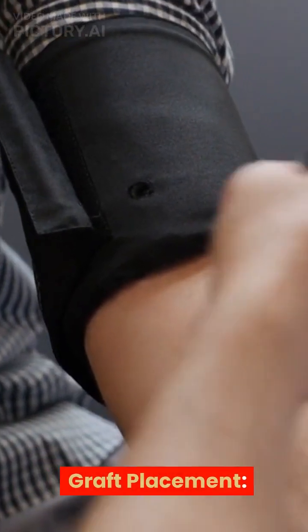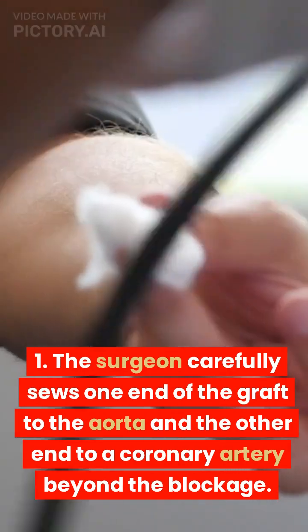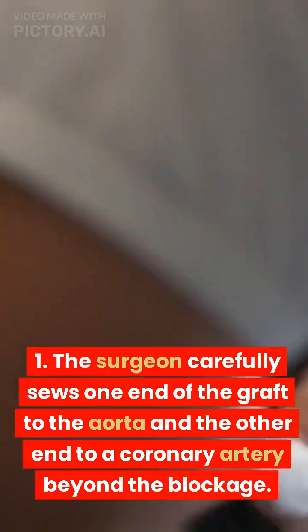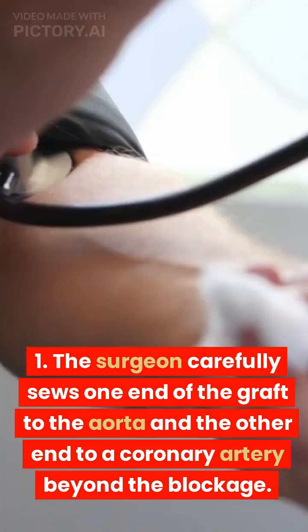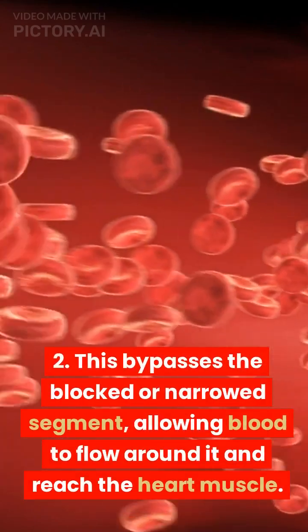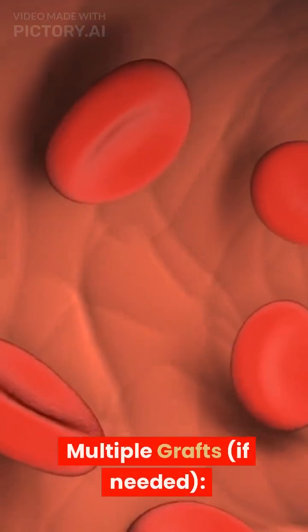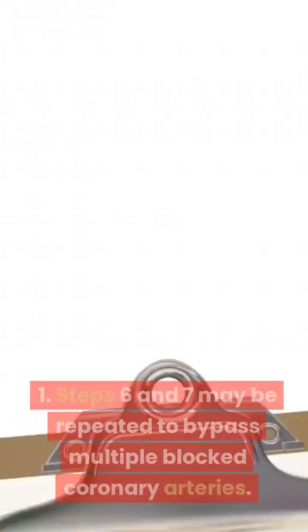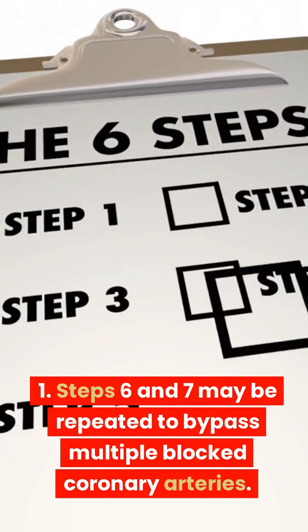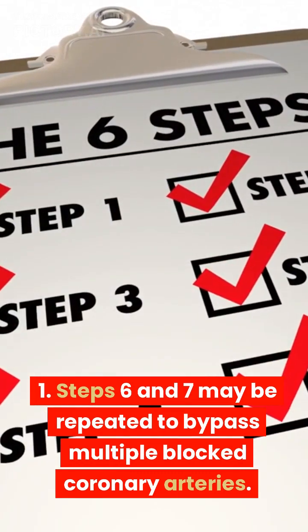Graft placement. 1. The surgeon carefully sews one end of the graft to the aorta and the other end to a coronary artery beyond the blockage. 2. This bypasses the blocked or narrowed segment, allowing blood to flow around it and reach the heart muscle. Multiple grafts, if needed. 1. Steps 6 and 7 may be repeated to bypass multiple blocked coronary arteries.